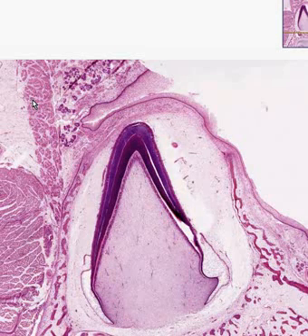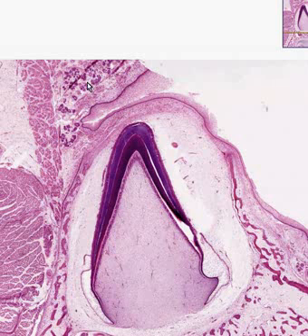This is an erupting tooth, and it is beautiful because it demonstrates everything. First of all, once again, you can see the overlying squamous mucosa. Secondly, you can see a good degree of development in the alveolar bone.